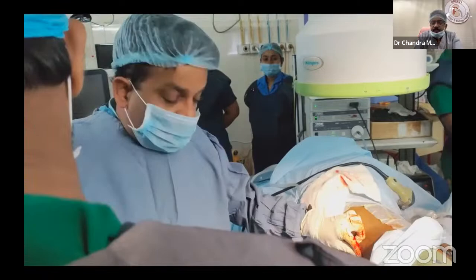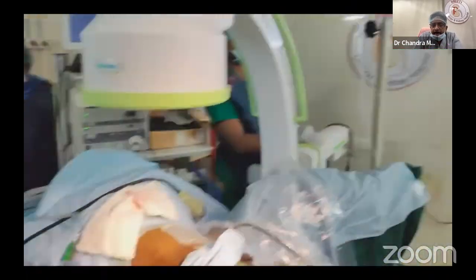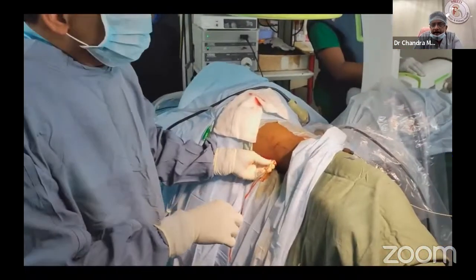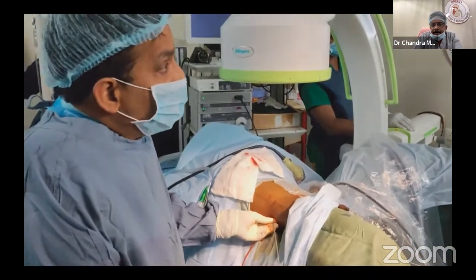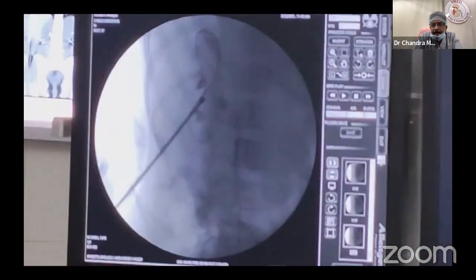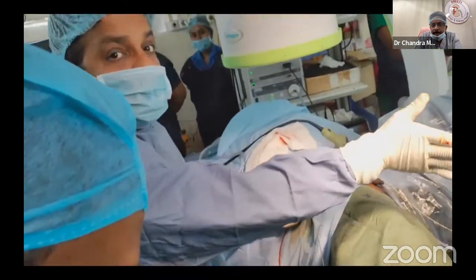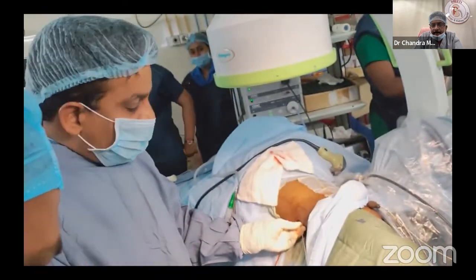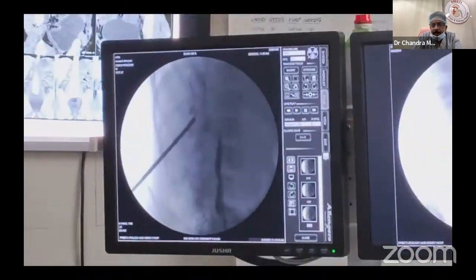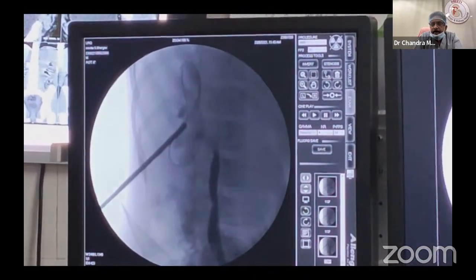Watch this, because I am used to it. Whatever you are used to, see, you go like this, turn this. This turning is important. You should not do dilatation in the wrong direction; the direction is like this to the upper calyx. Then you are safe. See how much I am towards the leg of the patient. In case you are not able to do it, move the leg to the other side. You should never aim the dilatation towards the pelvis.